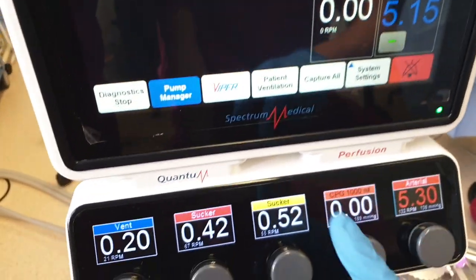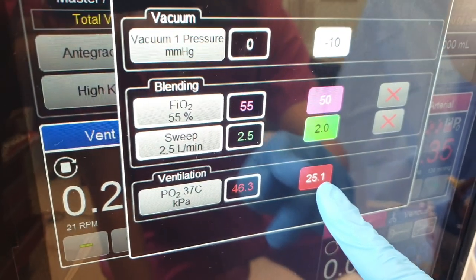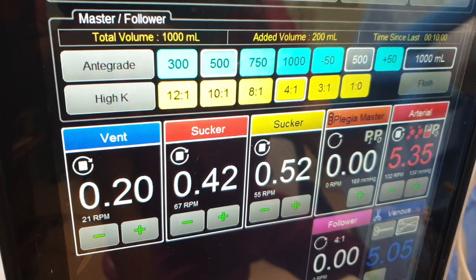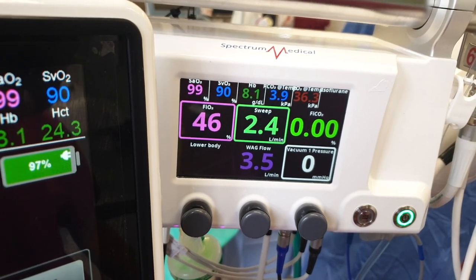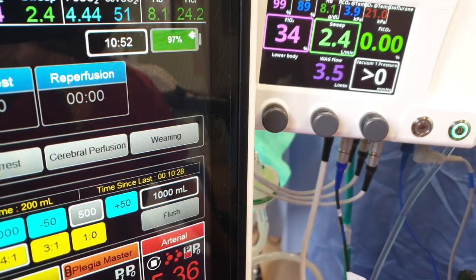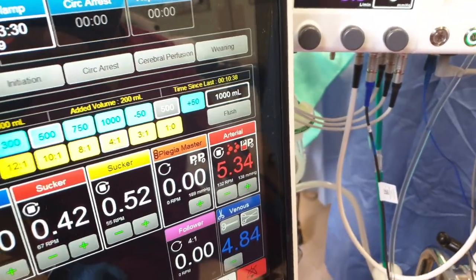Before that, there is one mode here, like ventilation and patient ventilation. If my target is 25, I'm happy with that. So this is your setting, right? I can do it like auto ventilation mode. So I will apply. See, this will adjust automatically if I use auto, but the sweep is manually adjusted, while the FiO2 is adjusted automatically. It will adjust if you use this mode, but you can always do manual. This patient ventilation mode can be used up to 32 degrees centigrade. That's the safest mode. It's not safe below 32 degrees centigrade.